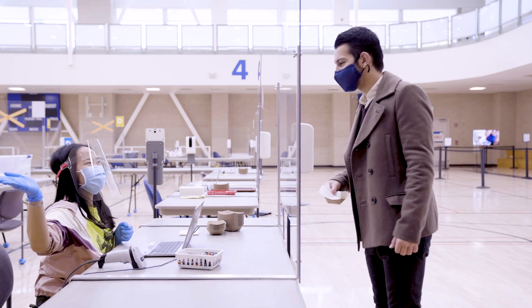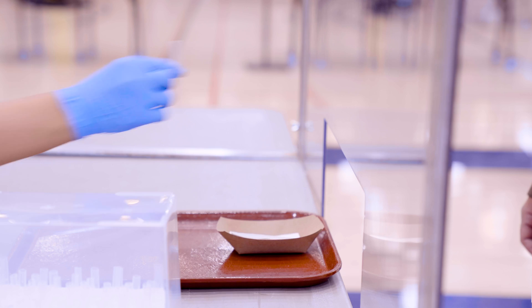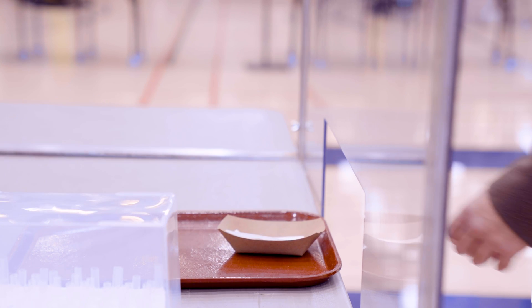Don't lose your vial. When you're done with registration, you'll be sent to pick up a straw and a pipette ball with some water.